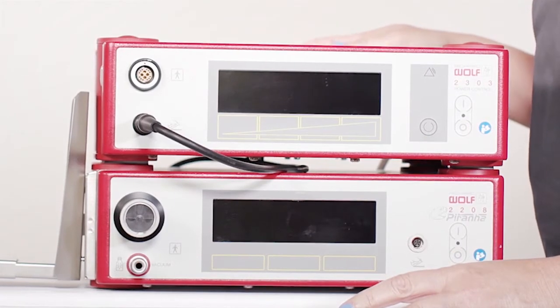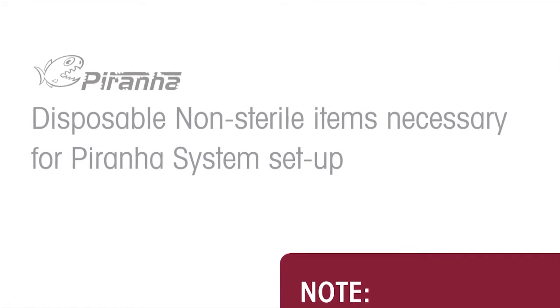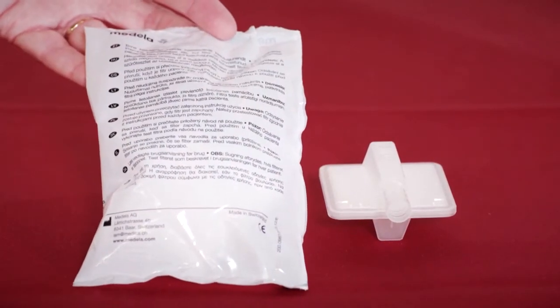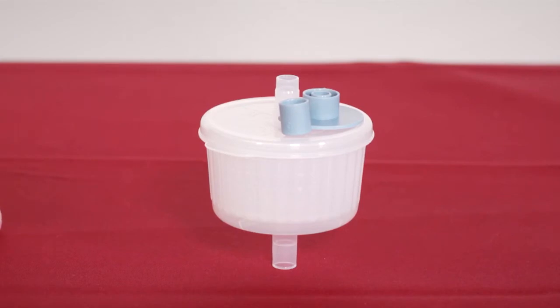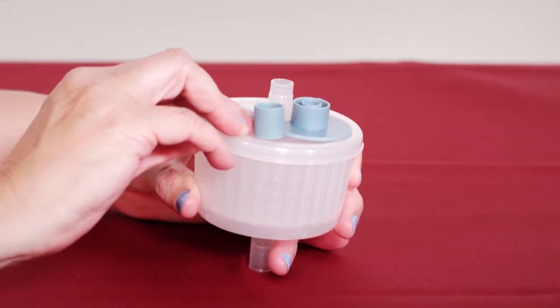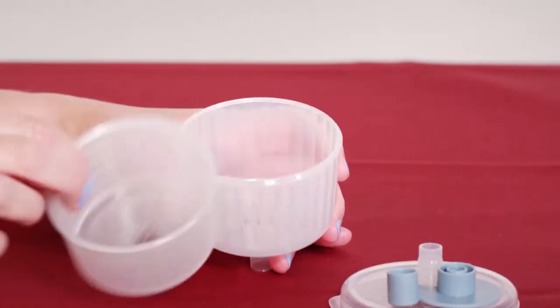Your unit is now assembled. Shown here is the disposable overflow protection filter in its package and out of its package. Shown here is the tissue trap, which is composed of three parts: the lid, the retaining mesh, and the container bottom.